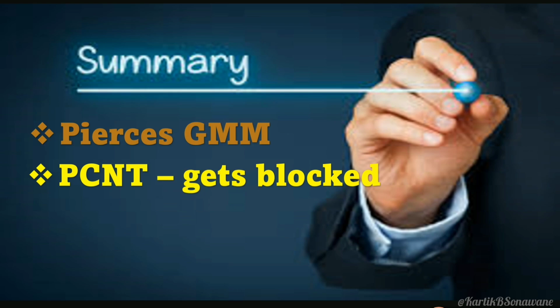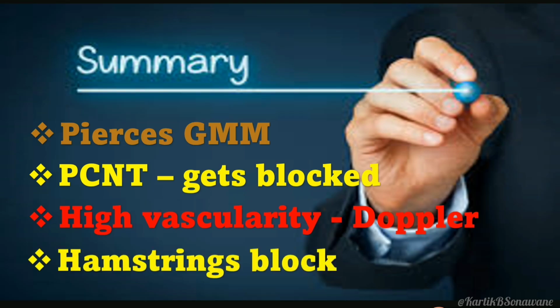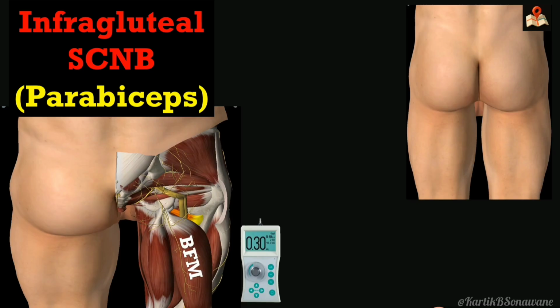Posterior cutaneous nerve of the thigh can often be blocked incidentally. Due to high vascularity, color Doppler is useful to identify and avoid vessels. Nerve to hamstrings may also be anesthetized depending on the location. The infragluteal approach is also known as Sukhani's approach.